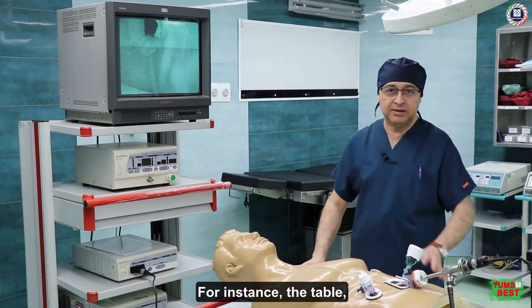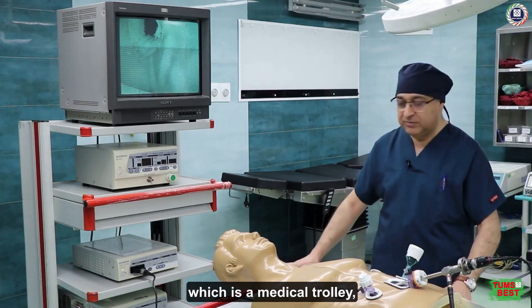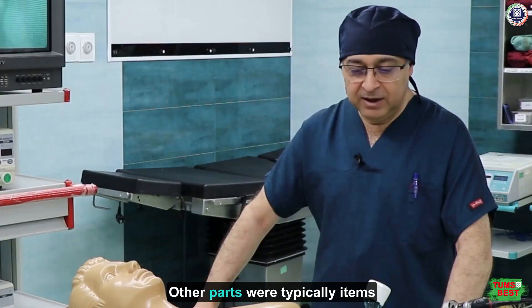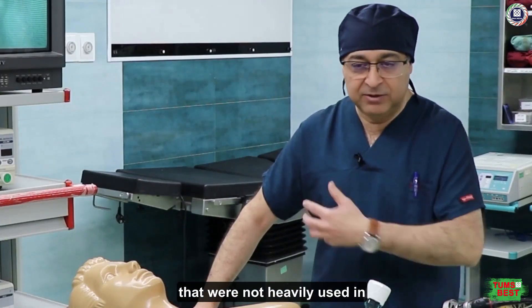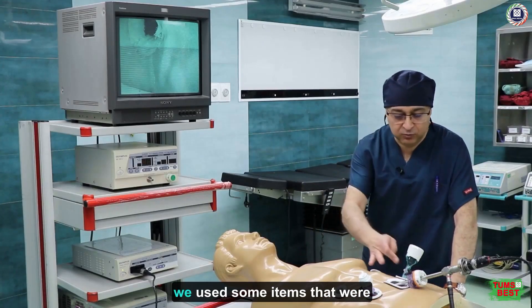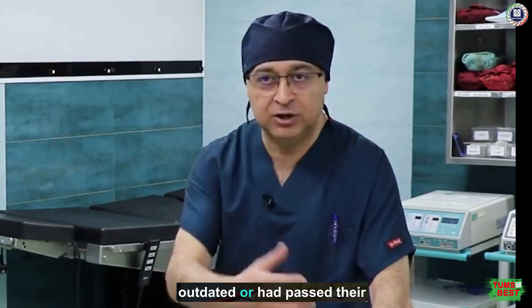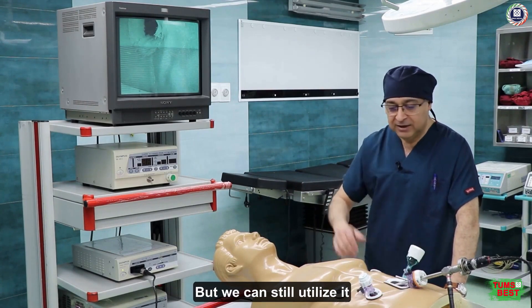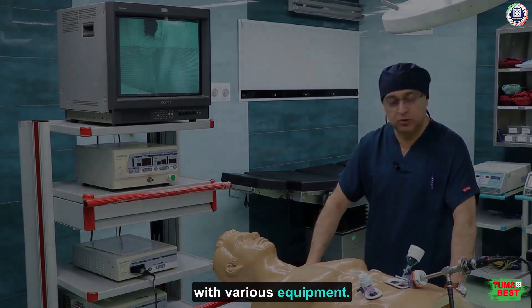For some parts we had to order from external companies. For instance, the table, which is a medical trolley, is fully adjustable in height. Other parts were typically items that were not heavily used in the hospital — for example, we used some items that were outdated or had passed their expiration date, but we can still utilize them with various equipment.